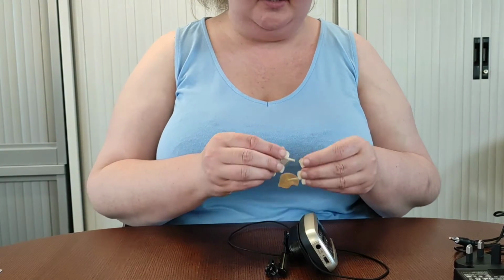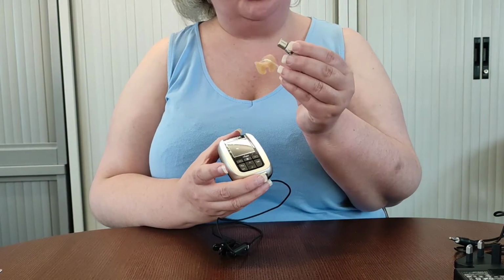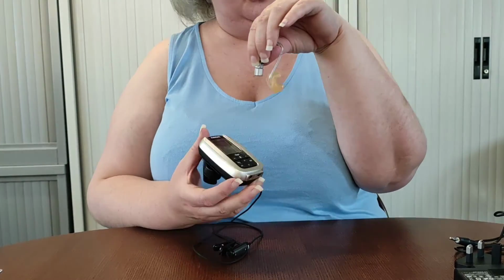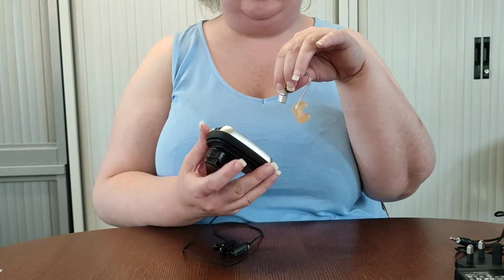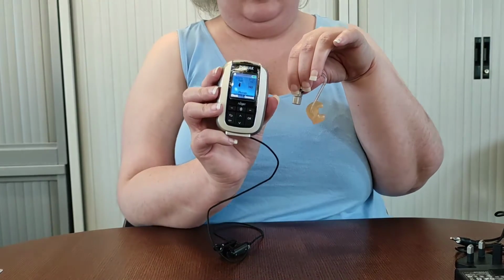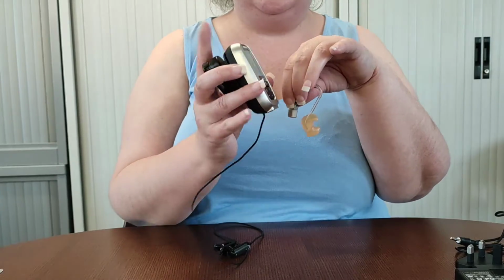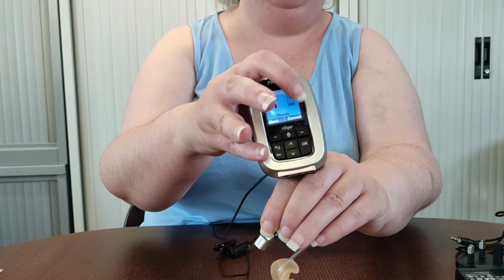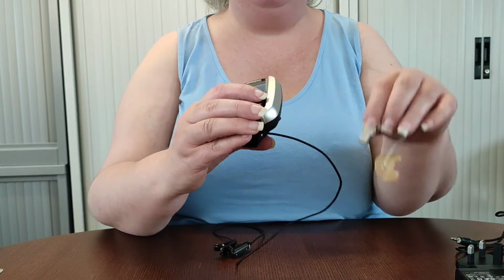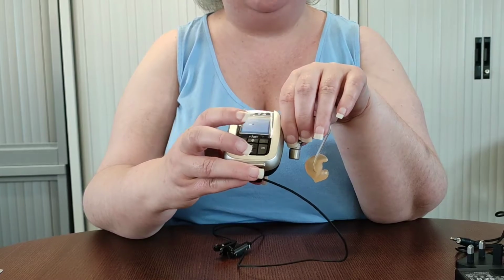So once it's all connected, how do we connect this device to the actual hearing aid now? So let's imagine this is being worn by your learner and it's all connected up. So we have our device that is on, our Inspiro. We need to see there is a button here and there's a word connect above it. So we're just going to have them very near each other within a few centimetres, and we're going to press that connect button.